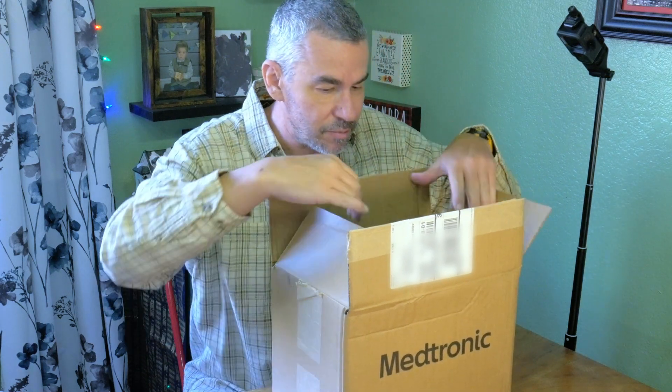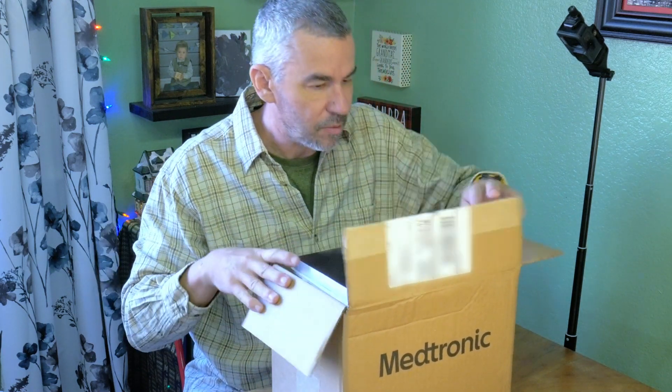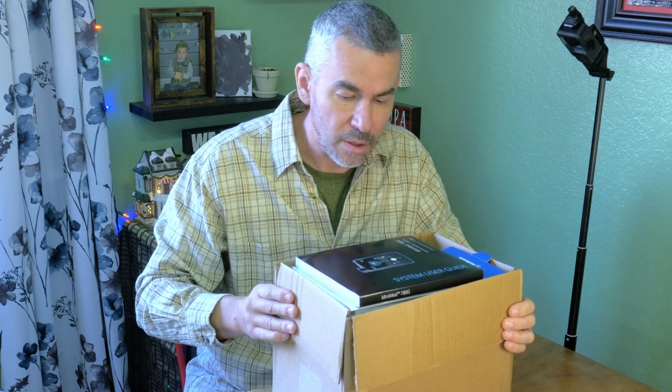So really quick, we're going to do an unboxing. This is what I got from Medtronic on the upgrade system. It's not a really big deal on the unbox.